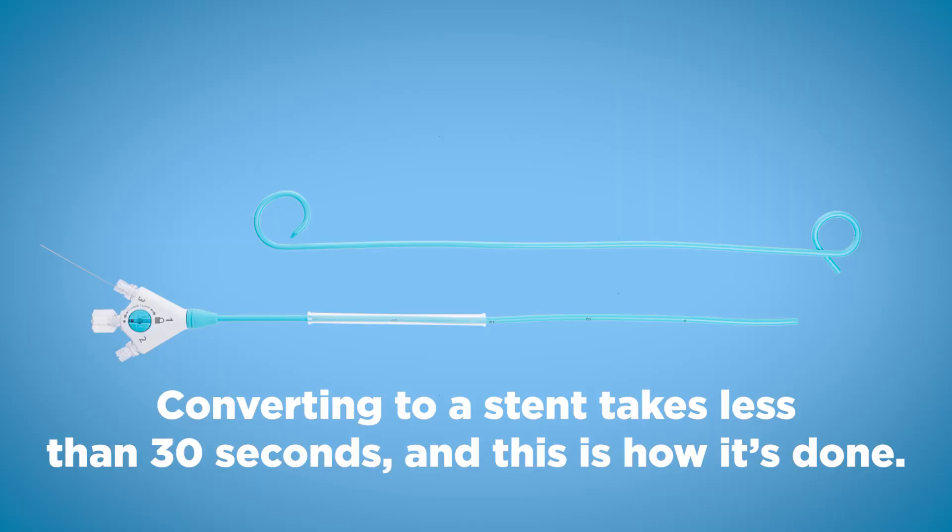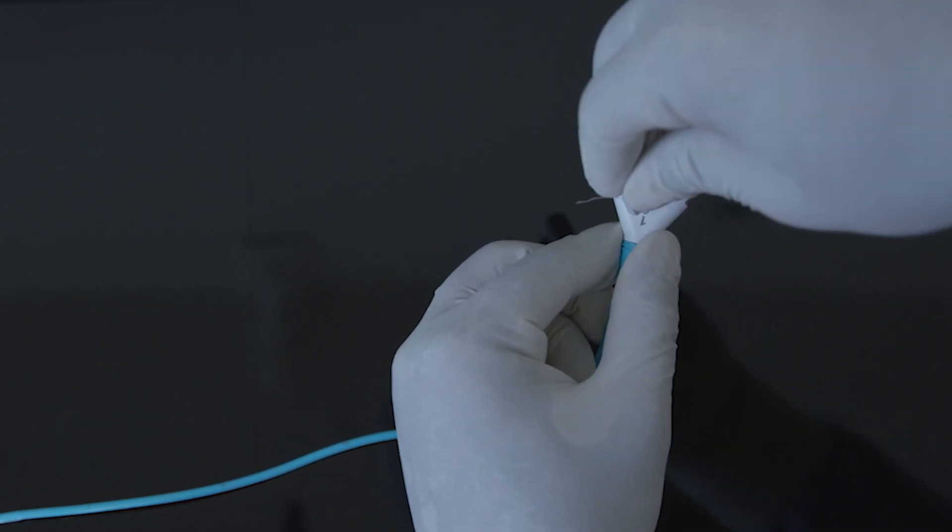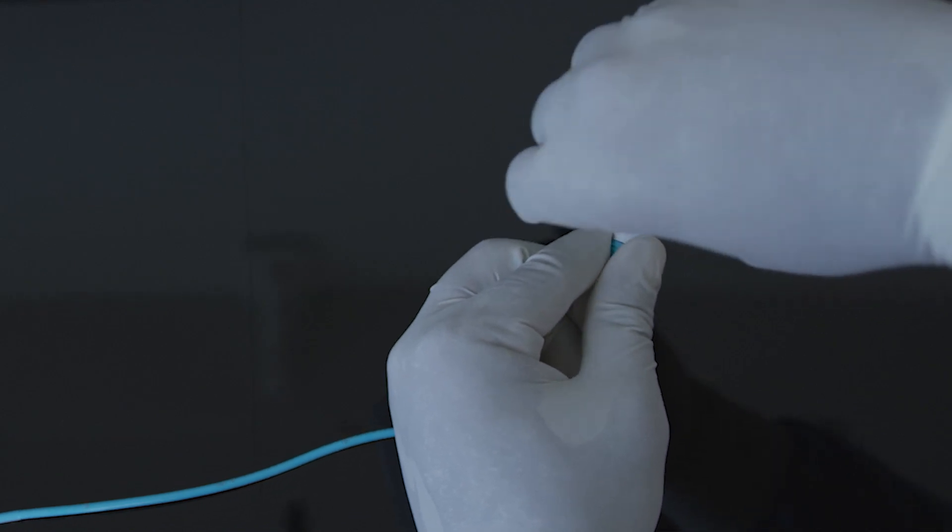Converting to a stent takes less than 30 seconds, and this is how it's done. If you would use the Convertex as an external drain, you would first need to unlock the hub.